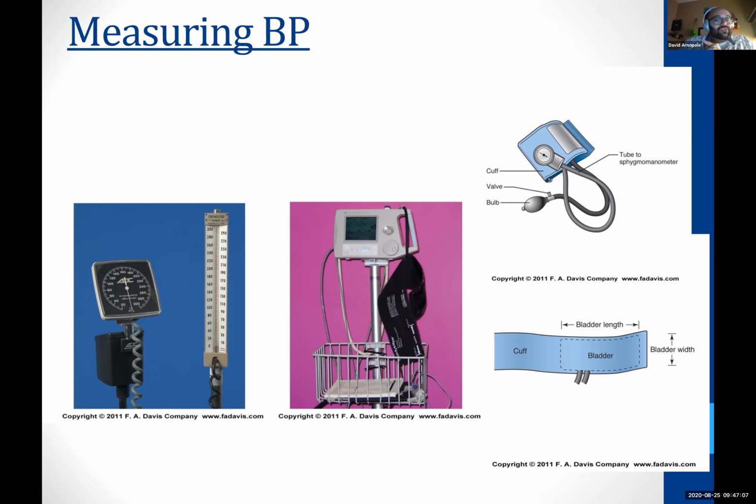Yes, and Madison, to answer your question, you're asking about rechecking a blood pressure. You do need to wait 4 to 5 minutes from checking a blood pressure on a specific arm. You can go to the other arm, but you may be restricted on that. But when you check it, you need to wait a few minutes beforehand to recheck it because your body is constantly under homeostasis. We've already talked about that. So when it starts seeing that there's squeezing, there's occlusions occurring, your body recognizes it and begins to elevate your blood pressure. So if you squeeze it, do the blood pressure once, and then do it again right after, more than likely it'll be slightly elevated. It'll keep doing it unless you let the body rest for a moment.